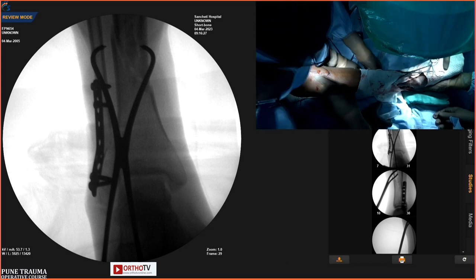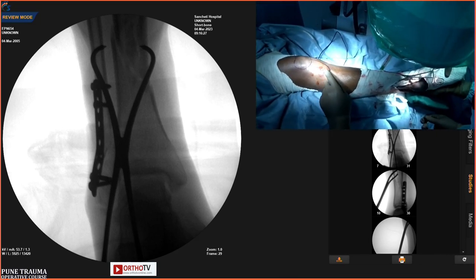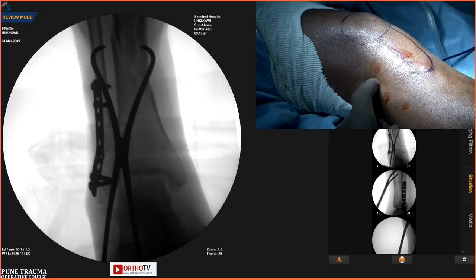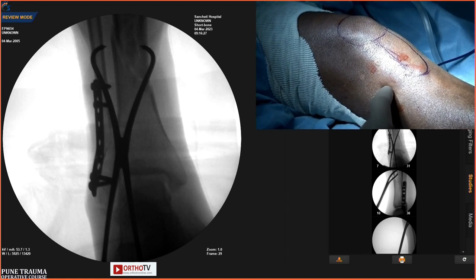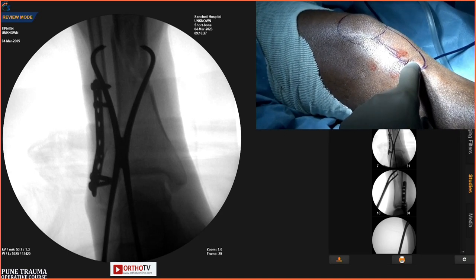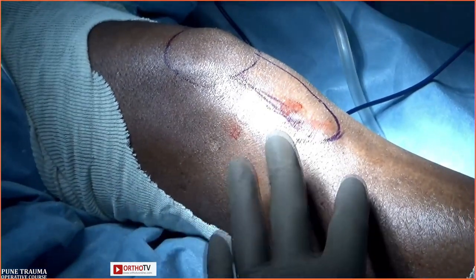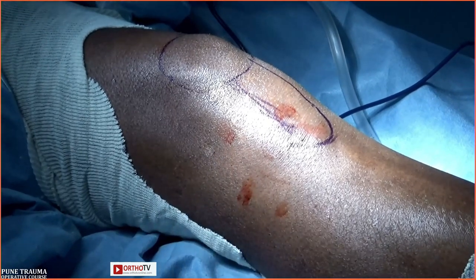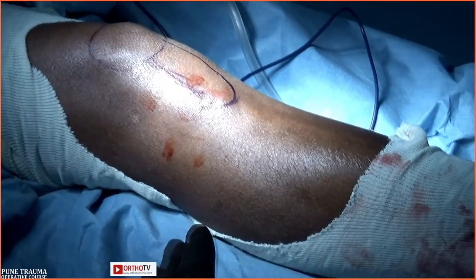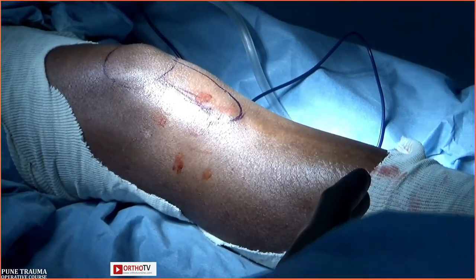This is the surface marking he has done already. And you can see here, this is the patella, this is the patellar tendon, this is the tibial tuberosity. Our nail should be about 5 to 6 millimeters below the subchondral bone. But in a distal tibia, it does not matter very much. So our nail entry point in a distal tibia should be just above the tibial tuberosity so that we can pass at least 3 screws proximally. And here we can pass 3 screws distally. Now regarding your question of whether the fibula should be fixed first or the tibia should be fixed first.